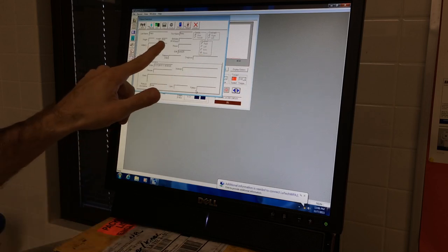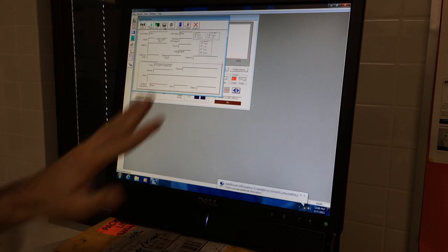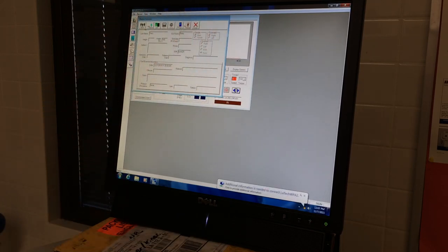We put his weight in, and then you see for his ID, we're just using the first part of his Louisiana Tech ID, or the first part of his Louisiana Tech email. Everyone's is unique. That's usually a really good way to do the ID. After you have all this information in, if you're going to do a new patient, you would hit add patient and put that in. Hit save. Since he's already in there, we don't have to do that. And we're just going to click our second tab, which is protocol.